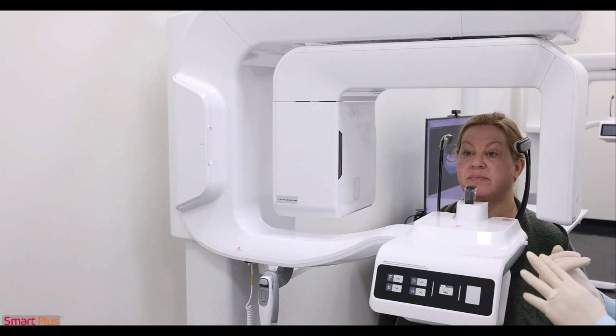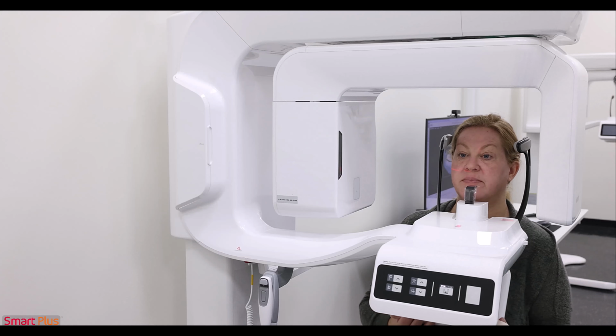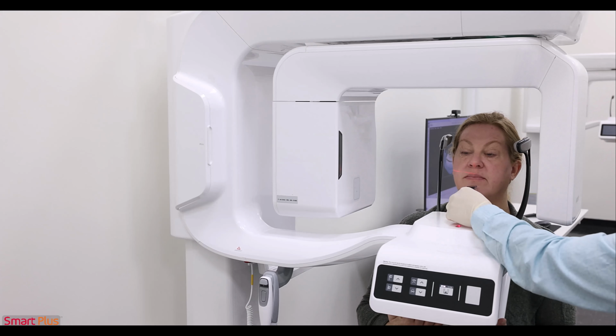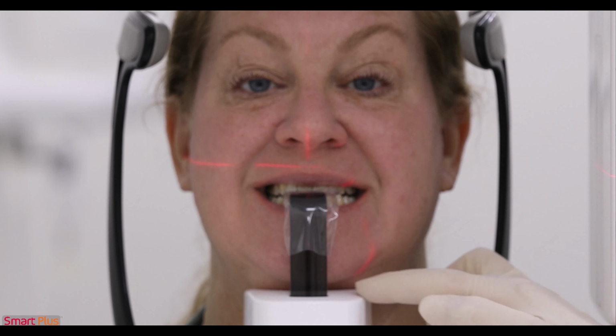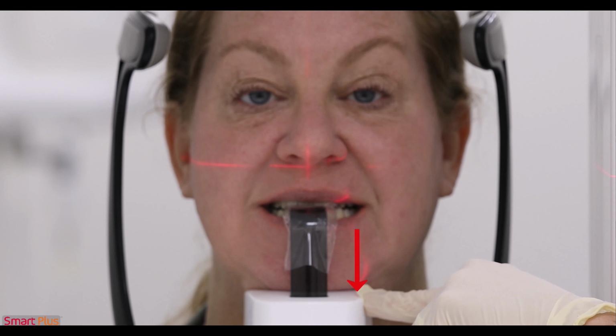We're going to start with our hands, our feet, and then bite on the bite stick. So go ahead and bring your hands up and palms facing up, feet shoulder length apart. And I'm going to go ahead and open and bite and smile really big. I can see the patient is in the bite stick groove and chin's off the chin rest a little bit. I'm going to gently push down to ensure that chin is firmly on the chin rest.